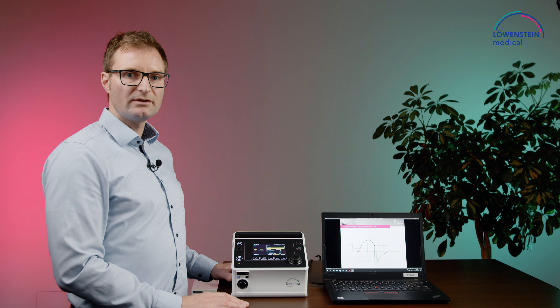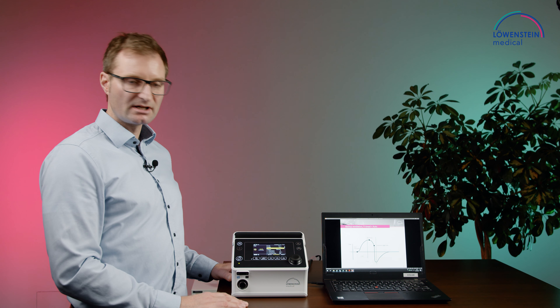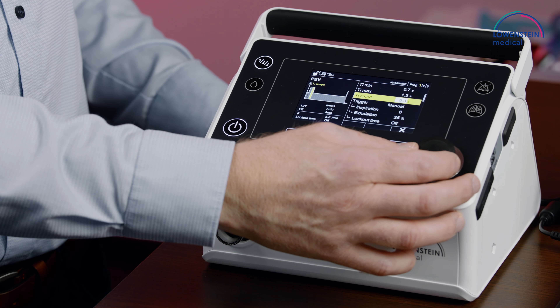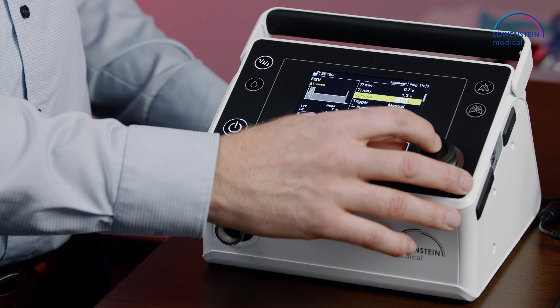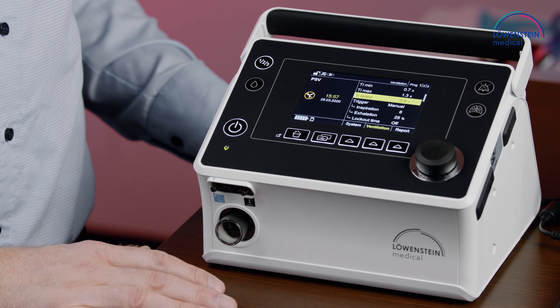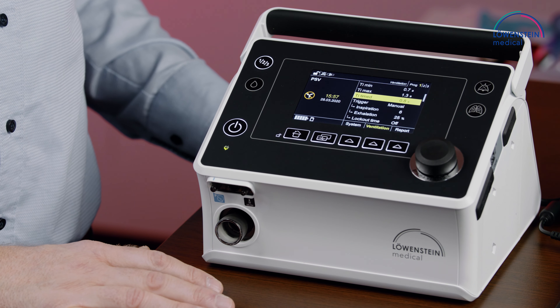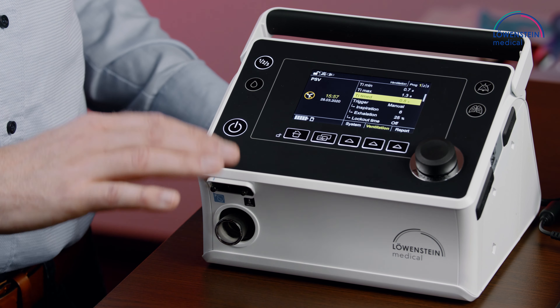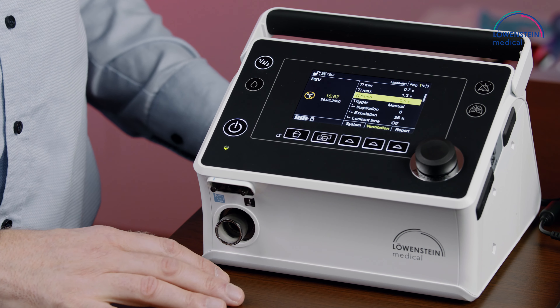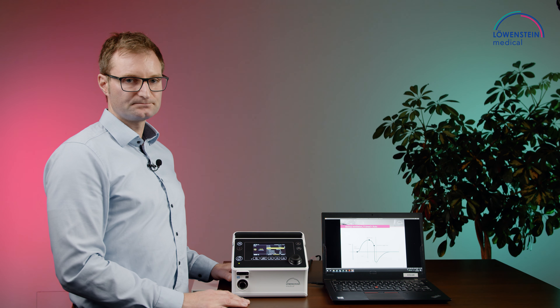Beside the auto setting, we can also set a fixed time — for instance, 0.8 seconds. And for the backup ventilation, the inspiratory time would then be fixed at 0.8 seconds.